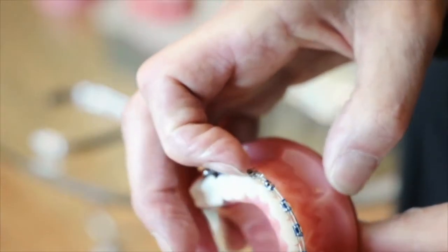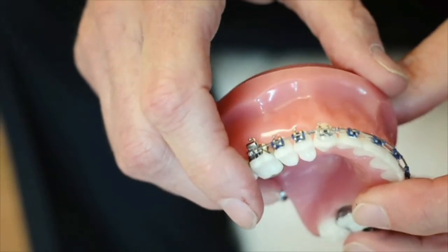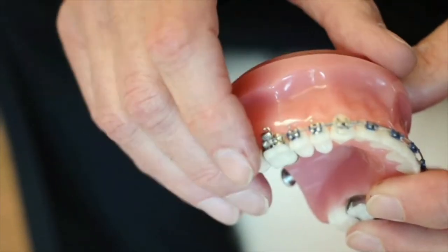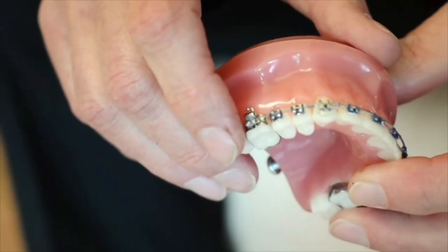Looking at how that goes — we have the spring here placed toward the incisal edge. We've figure-eighted everything together all the way back to the bicuspids in this particular case, and once you've activated it, it puts pure labial root torque to that cuspid. Within 12 weeks you're going to have a canine eminence. That makes life real easy rather than struggling, because we do have torque in our brackets but it's not nearly enough, especially in situations like this.